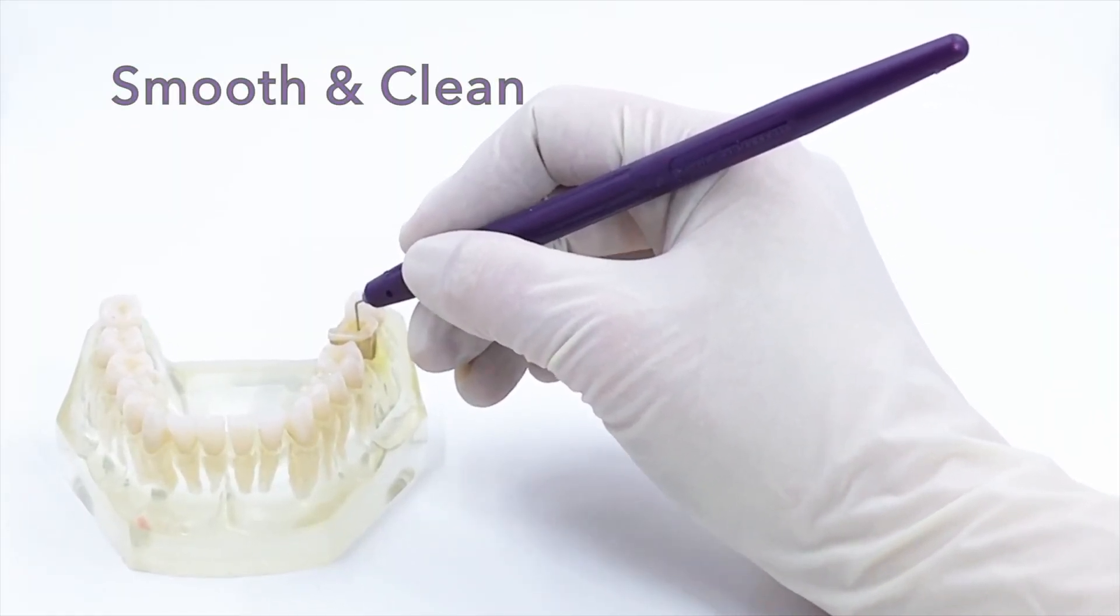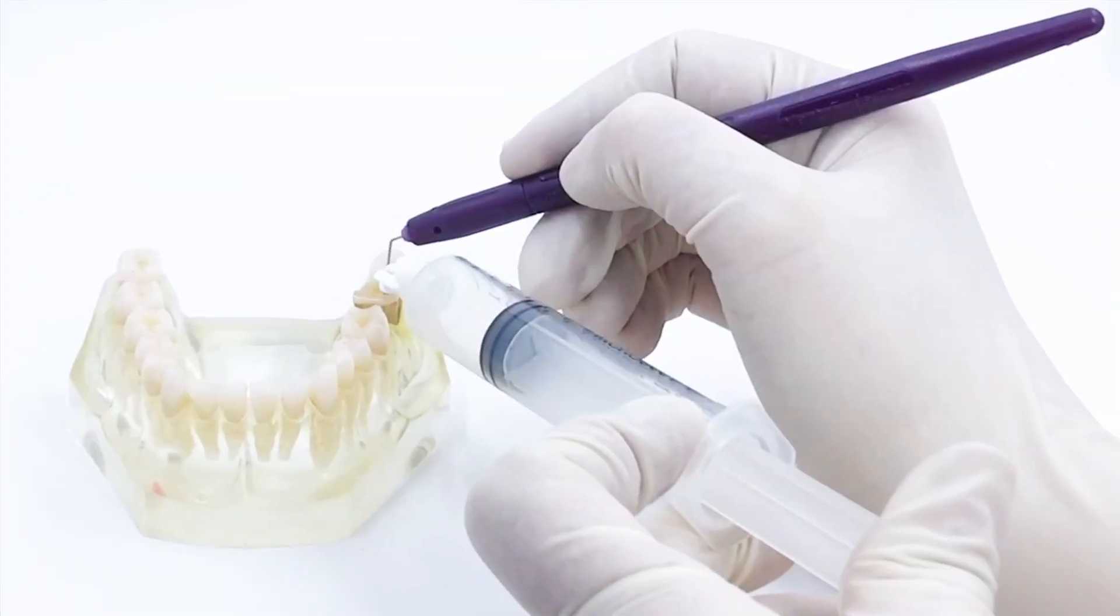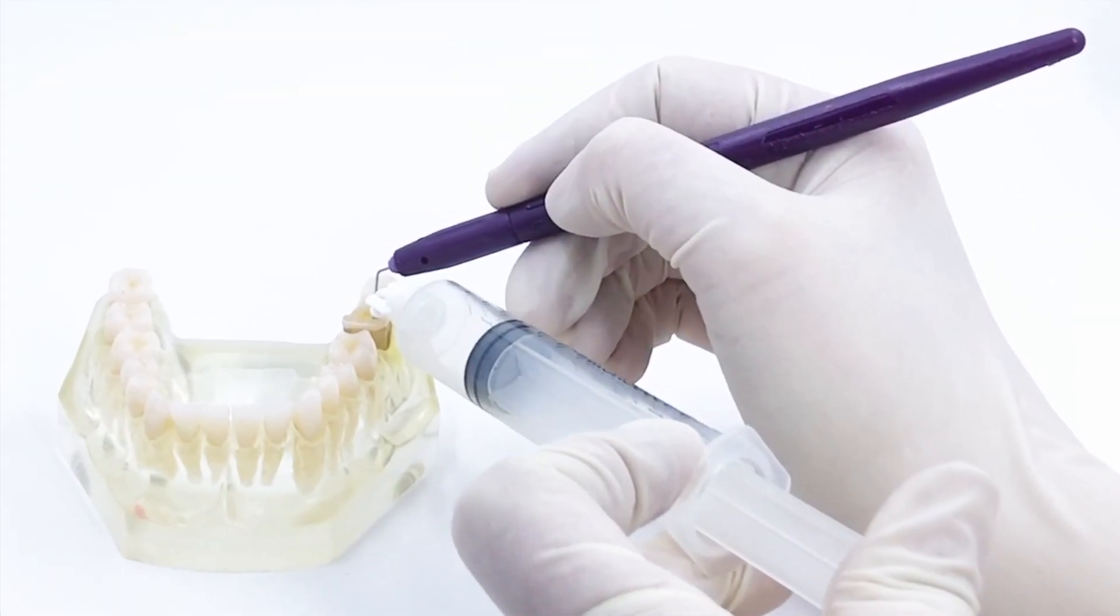You can create a smooth, clean glide path in under two minutes and lets you irrigate while filing.